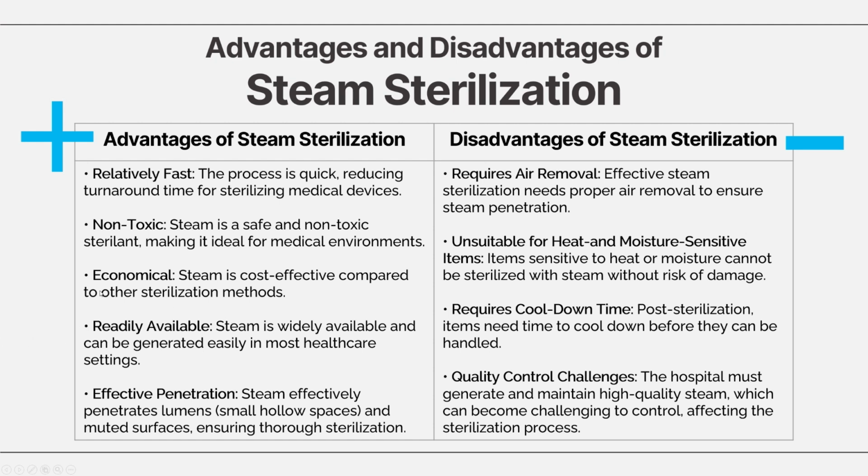It's also economical for that reason alone, right? Water and energy are the primary resources needed. So compared to other methods, again, like ETO, steam is far more cost effective for routine sterilization. So when I say routine, it's used every day.